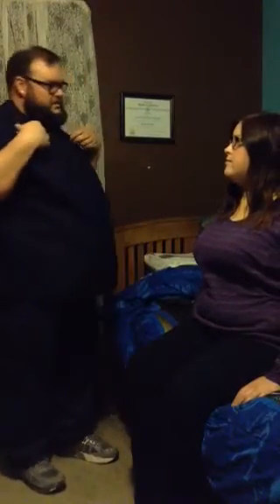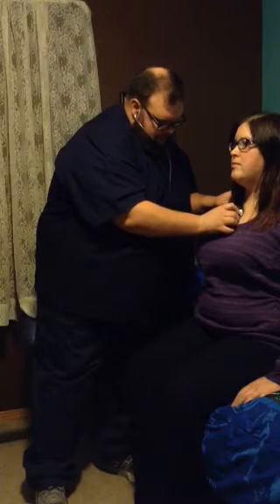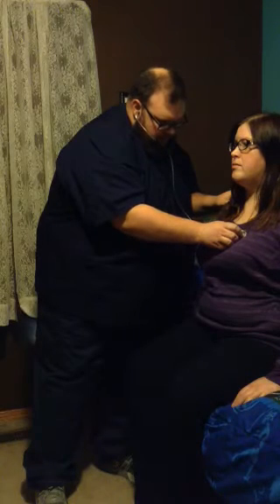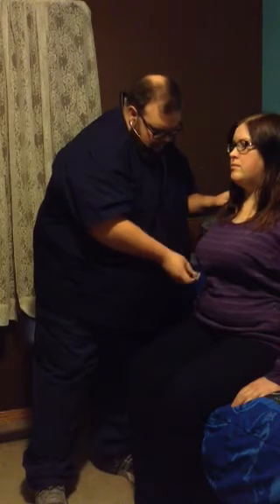Next, I'm going to auscultate your lungs. I'm going to listen to your breath sounds. I want to make sure there's no wheezing, rubs, crackles, or rhonchi, okay? Okay. And just breathe normal. Breathe in. And you want to allow for a full inspiration and expiration. And also, again, do posterior.